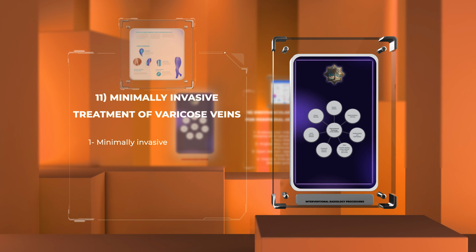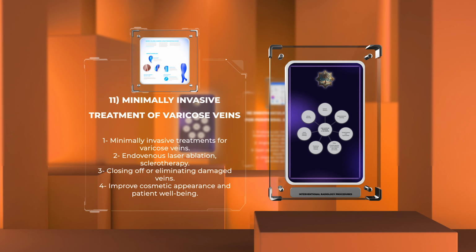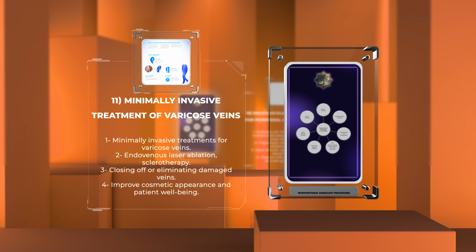Varicose veins are a common venous disorder that can cause pain and discomfort. Interventional radiology offers minimally invasive treatments such as endovenous laser ablation or sclerotherapy to address this condition. These interventions involve closing off or eliminating the damaged veins, improving both cosmetic appearance and patient well-being.